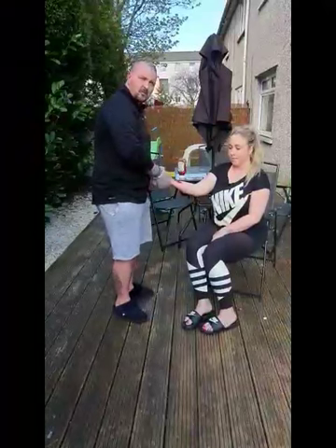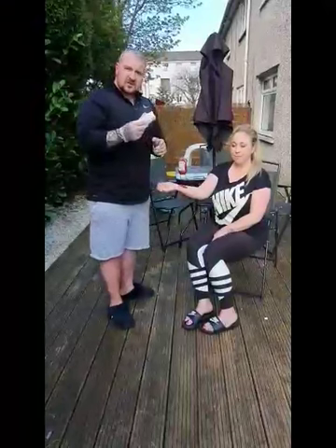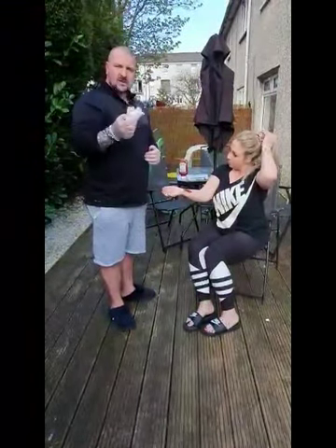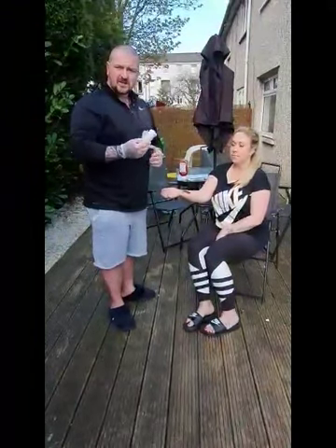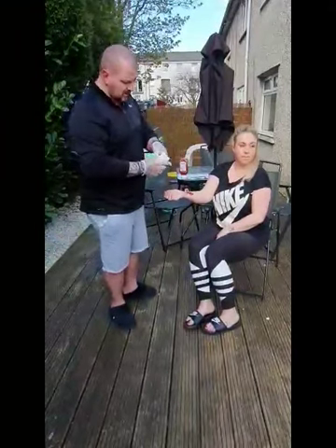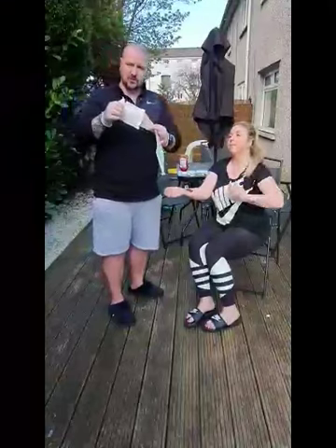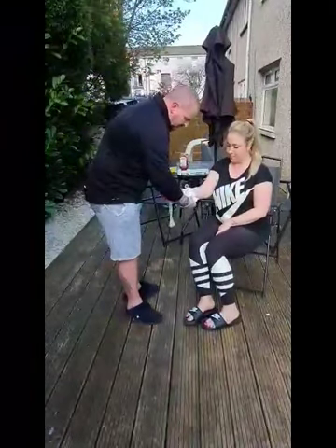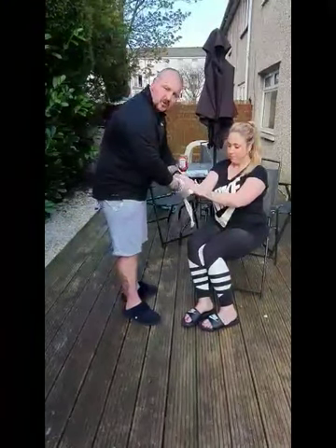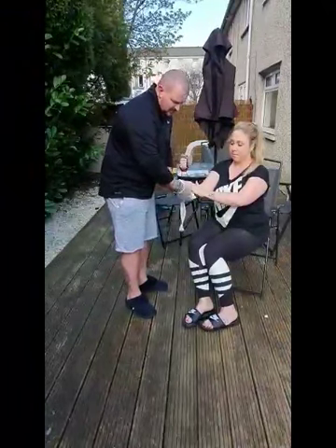The next thing I want to do is cover it up — once I've cleaned it, cover it up. I'm going to use a medium sized dressing here. In your first aid packs you'll get sterile, undamaged and in-date dressings. As soon as you rip that packaging open, it's ready for use. I'm going to open my bandage — you'll see the padding here. The padding is going to go over the wound. I'm going to get my wife to hold the wound and apply her own pressure, which frees up my two hands to bandage it up.